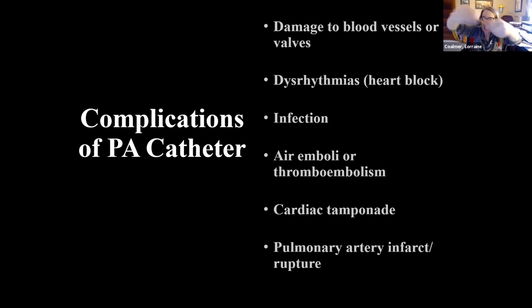And I want you to see how long this catheter is. You see that? If you have the opportunity, back at school or whatever, we'll set one of these out. But you have to know where it's marked, because it could slide forward or it could slide back, and it won't be in the right place, and then we have problems.